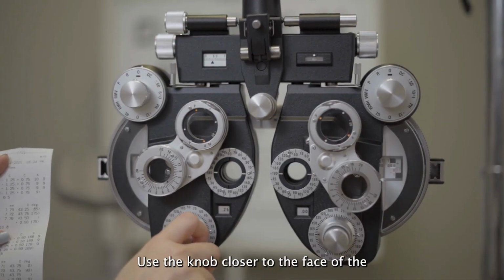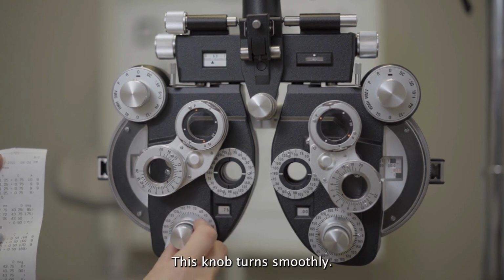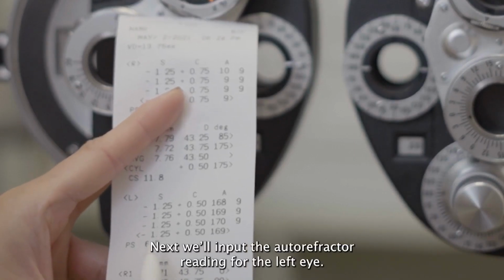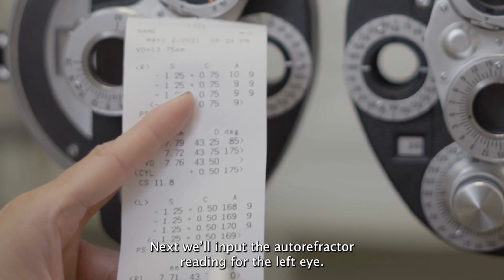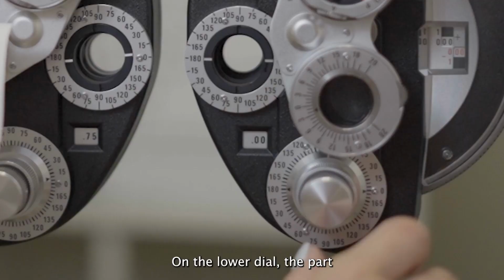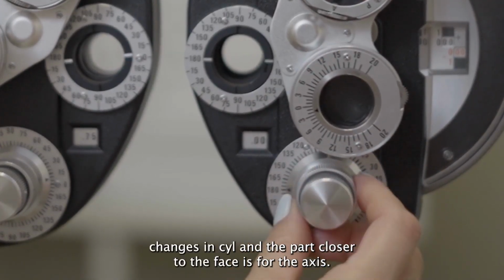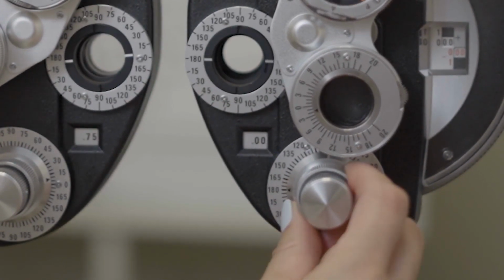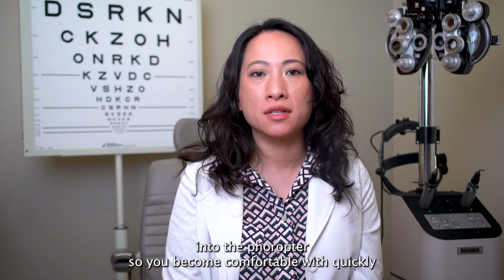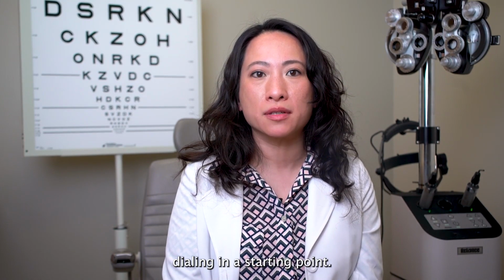Use the knob closer to the face of the phoropter to input the axis. This knob turns smoothly. Remember, the markings are in increments of 5 degrees. Next, we'll input the autorefractor reading for the left eye. Again, the large dial on the side is for the sphere. On the lower dial, the part closer to you changes the cyl, and the part closer to the face is for the axis. At this point, it is recommended that you try to practice inputting various prescriptions into the phoropter, so you become comfortable with quickly dialing in a starting point.